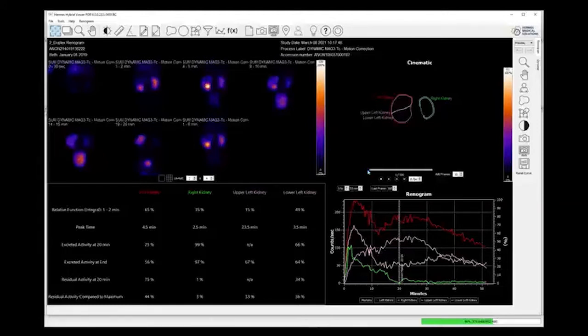You know, I just think that it's a big step forward, and it's going to be a huge help in the clinical environment. It's so niche as a thing that people want to do, but that's what Hermes is for, these very niche cases that are tricky to handle elsewhere. Yeah, certainly. As I say, I've only had limited time to play with it currently, but certainly what I've seen of it, it's really nice.